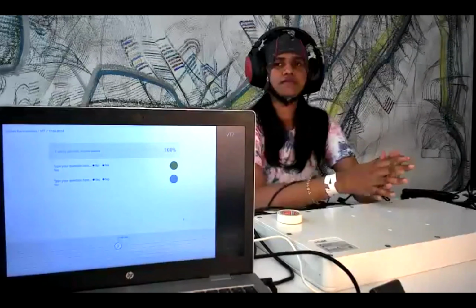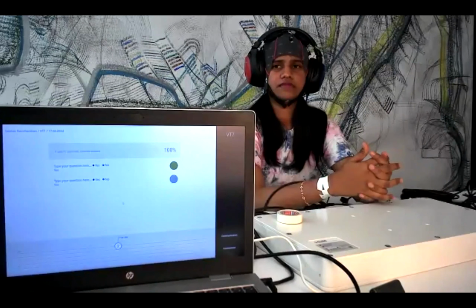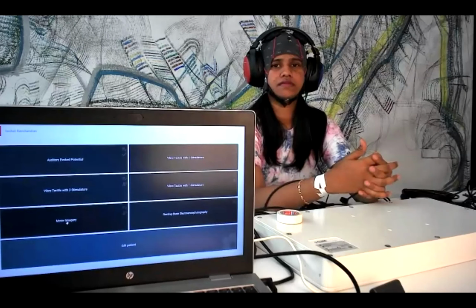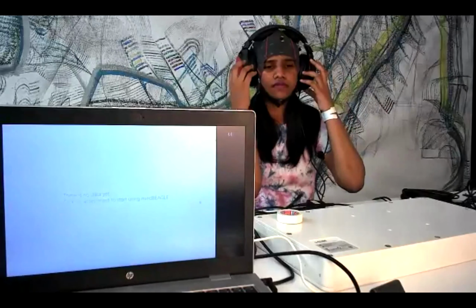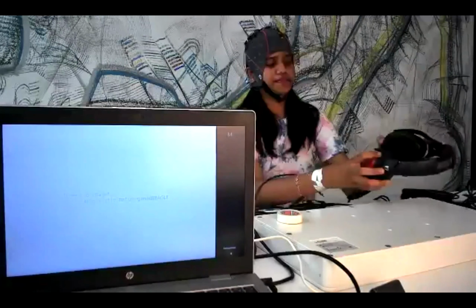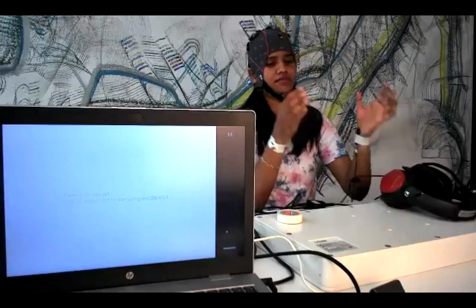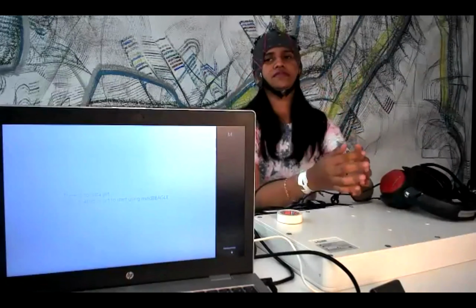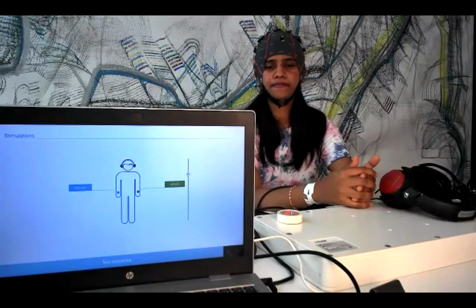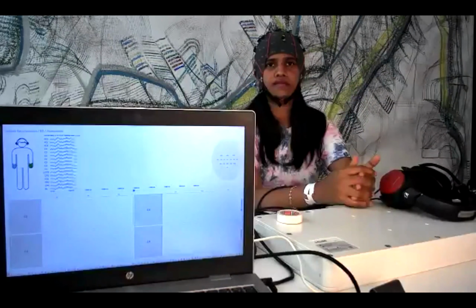The last thing I want to show is the motor imagery paradigm. So I hope you can still see it here. So the motor imagery paradigm, we have it here. So we also have the assessments and the communication. Of course, we first need to do the assessments, and we have the left and right wrist. That's the instruction for imagining the left and right hand movements. And we have a marker here.